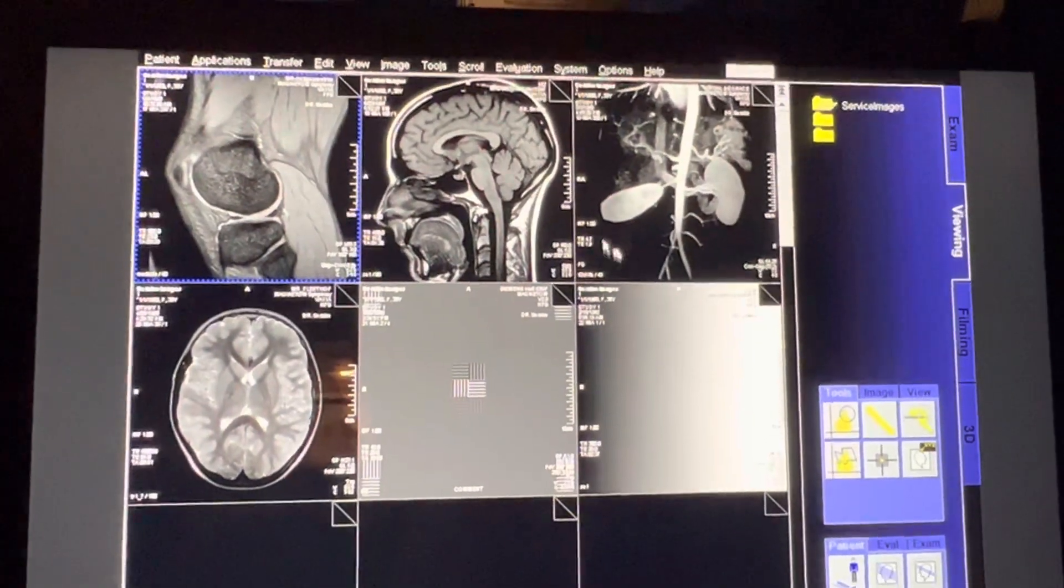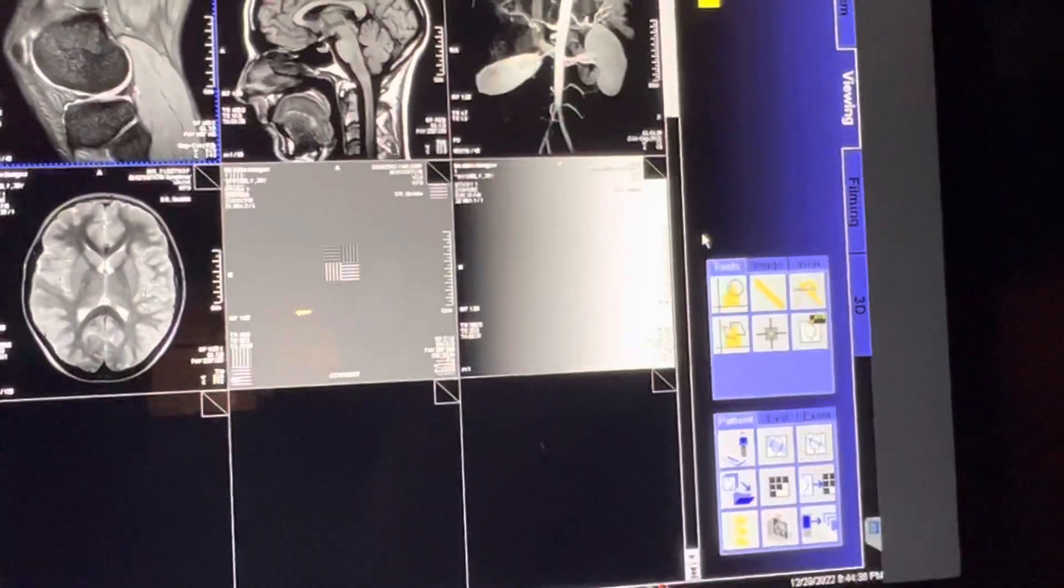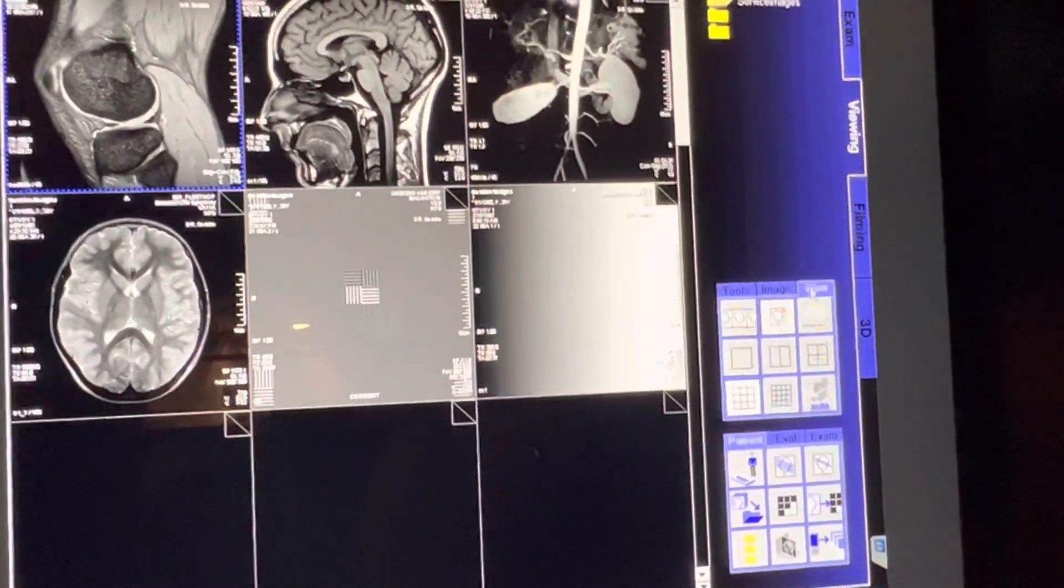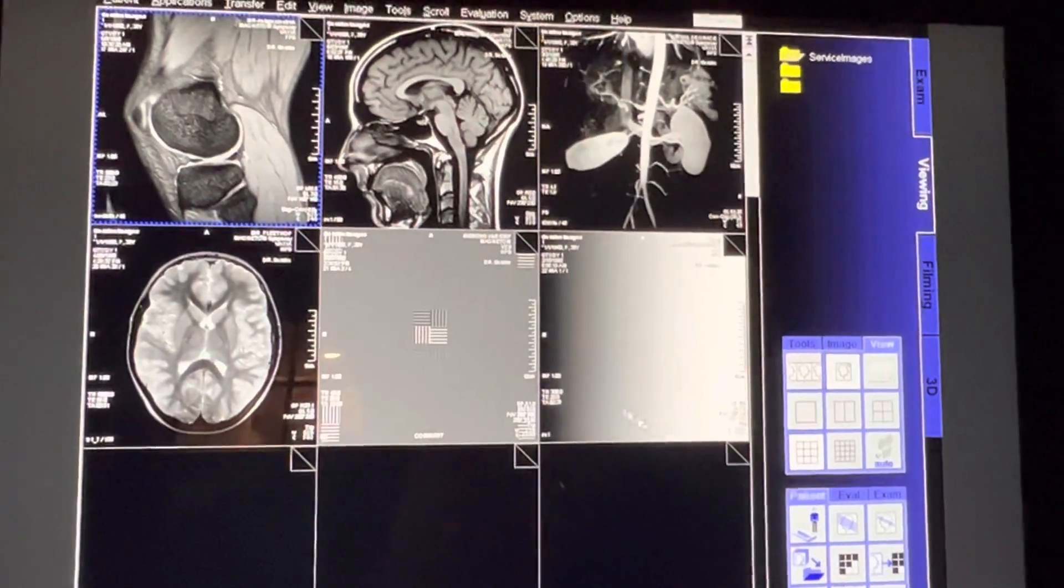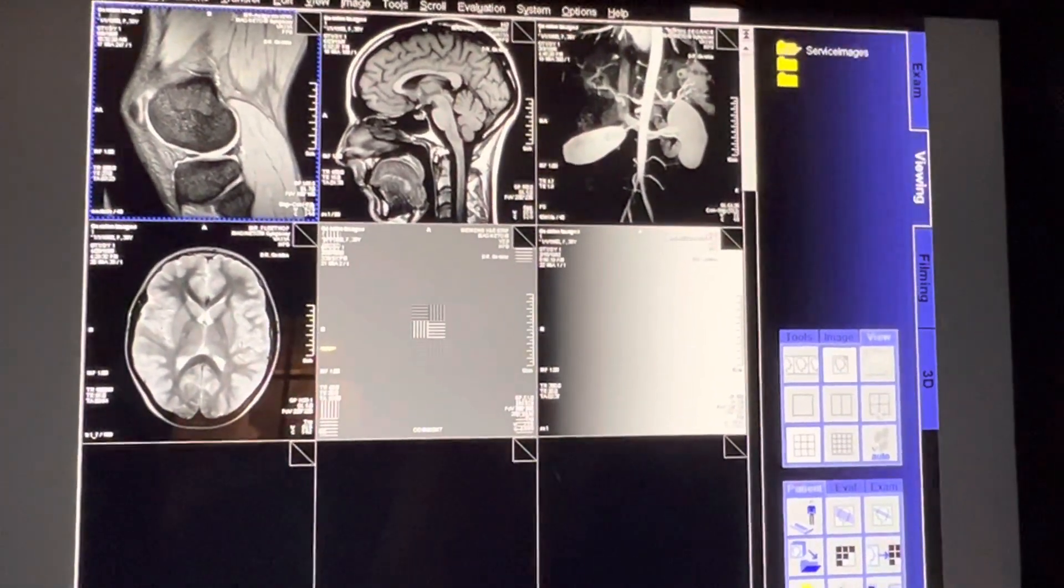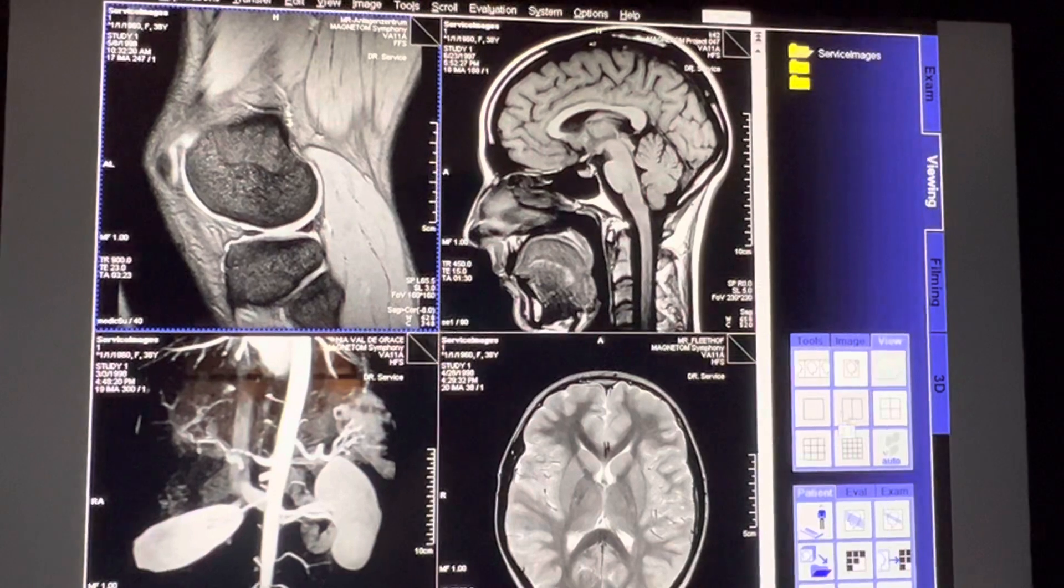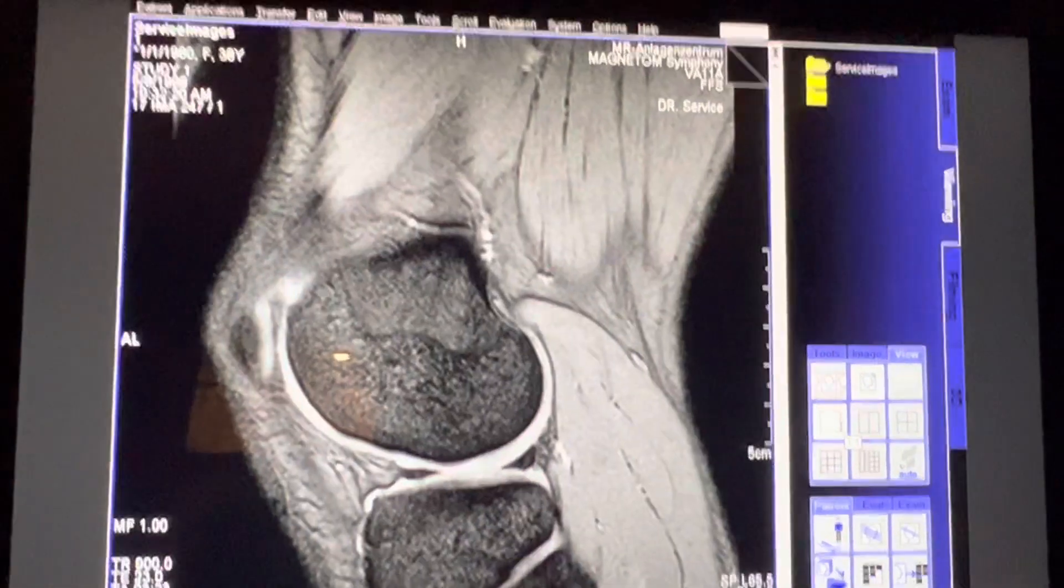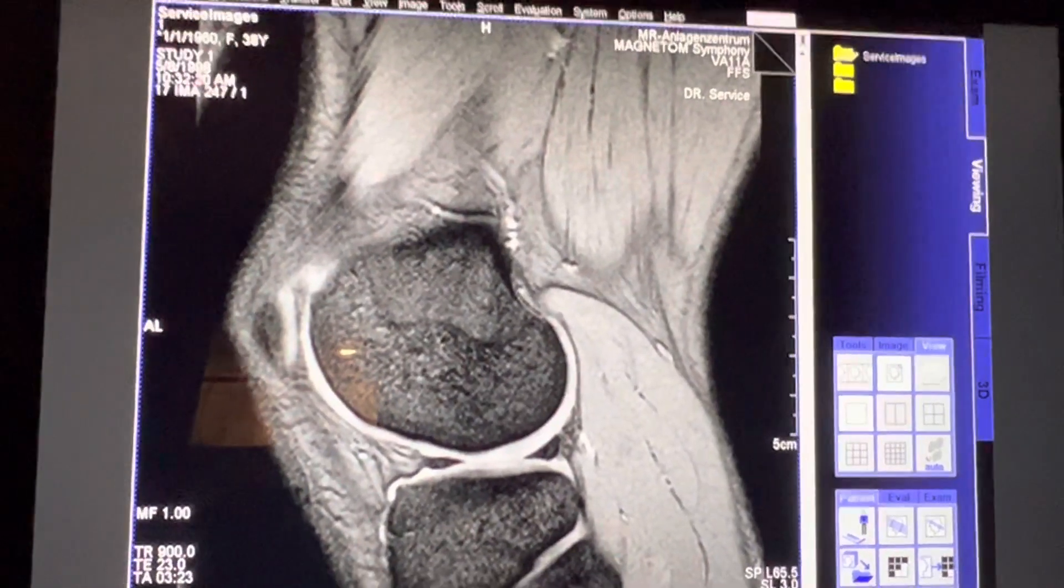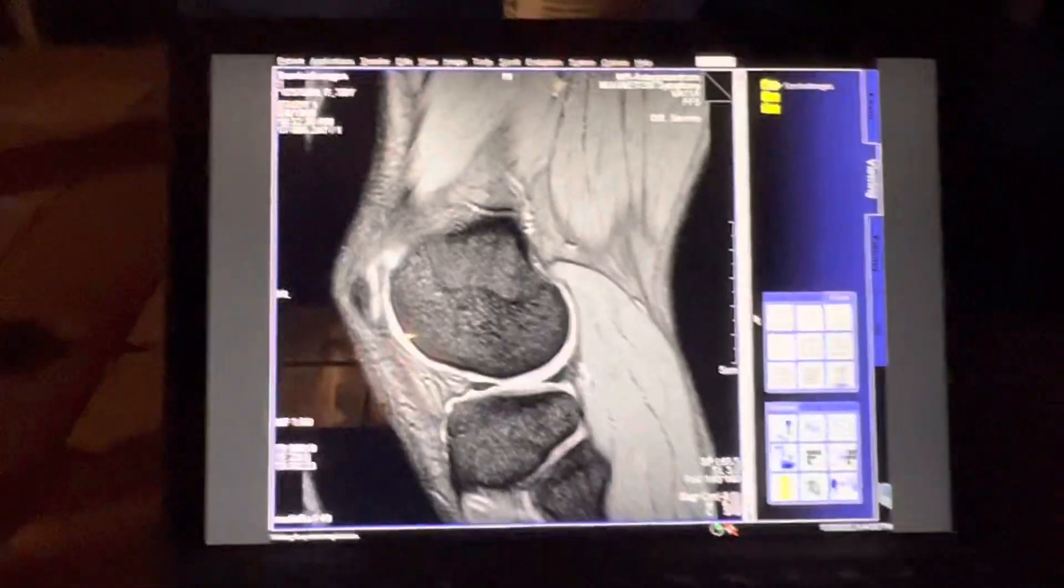Boom! There are all my images. Now you can change the view. Currently I have nine on one. We can go to four on one, two on one, or one on one.